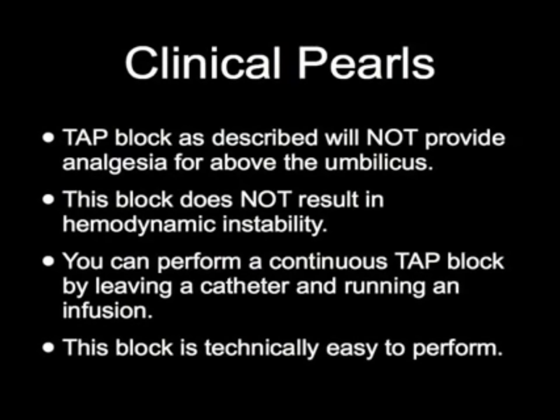Clinical pearls: the TAP block, as described, will not provide analgesia for above the umbilicus. This block does not result in hemodynamic instability, in contrast to an epidural or spinal. You can perform a continuous TAP block by leaving a catheter in running an infusion. This block is technically easy to perform.